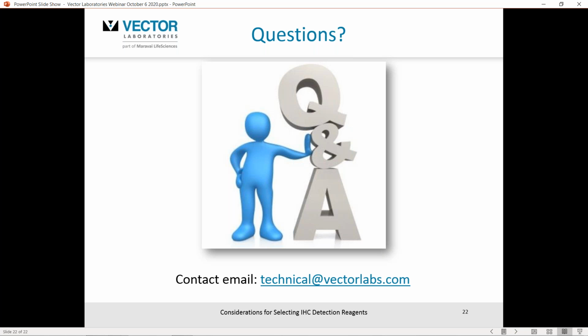Okay, I'll interpret that as being a secondary antibody interaction with the primary or the tissue type. So, for example, let's use the example I used a little bit earlier on, say a mouse primary antibody being applied to a mouse specimen. I hope I'm interpreting this question appropriately, whereby you're using an anti-mouse secondary antibody to recognize that unconjugated mouse primary antibody.